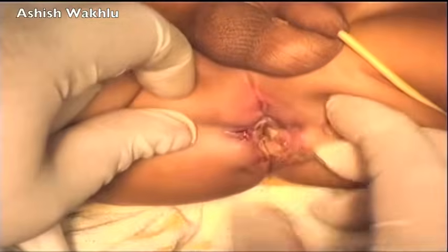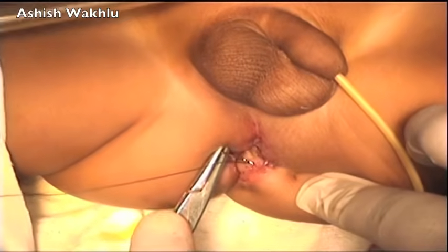You can see the white scar tissue, which denotes the place where an attempt at an anoplasty was made in the first operation. Sutures to open out the scarred area and facilitate the tunneling into the peritoneal cavity.